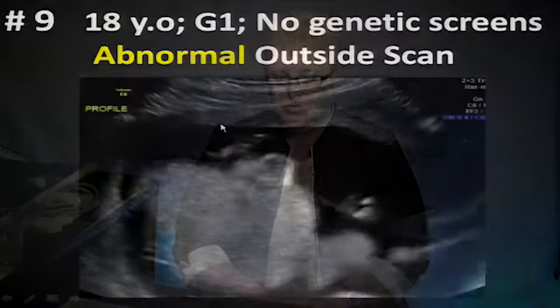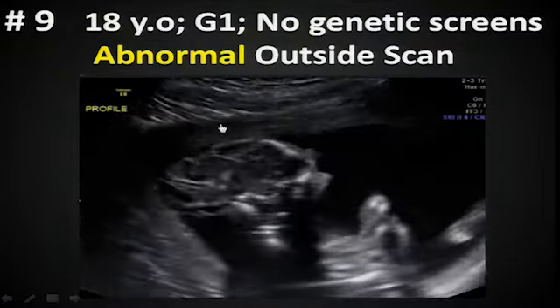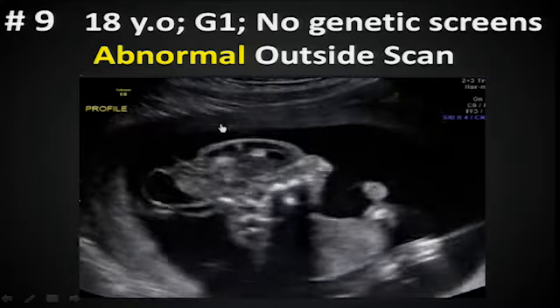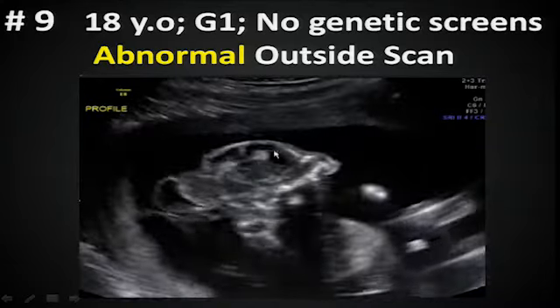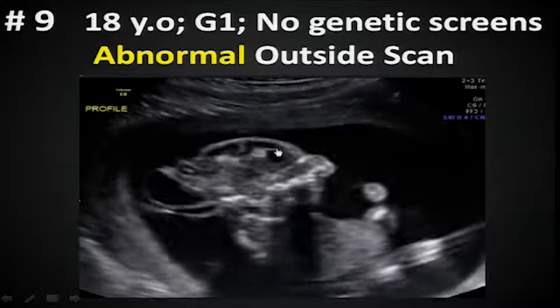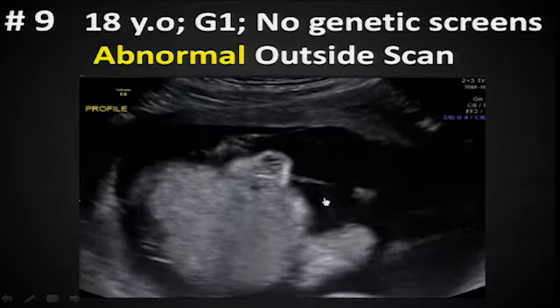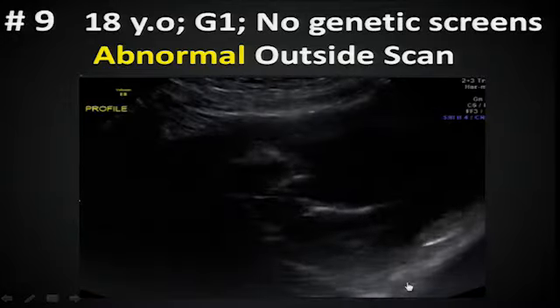All right, this one is an 18-year-old, first pregnancy. She's just so happy; all she wanted to know was the gender of her baby. No genetic screens, and all they sent in on the referral was abnormal ultrasound. So it's the sagittal view, looking at the top of the head, the face. Pay attention to these little lines here. And looking at the back of the head, spine, torso, hand, legs, down to the tush.